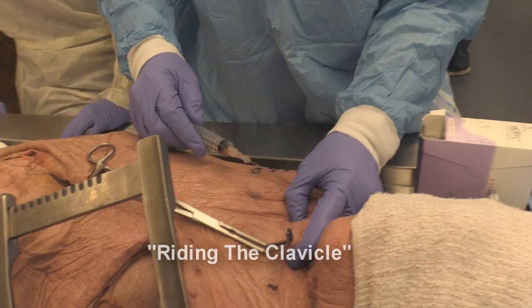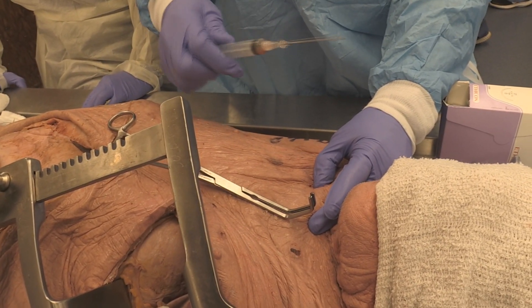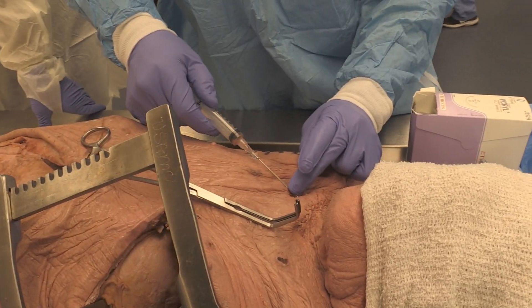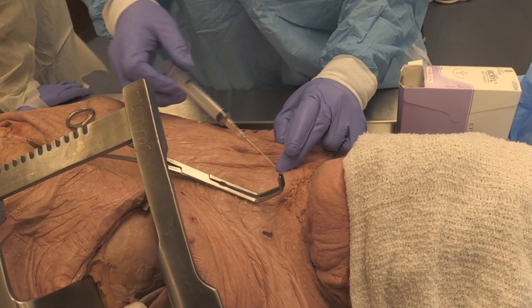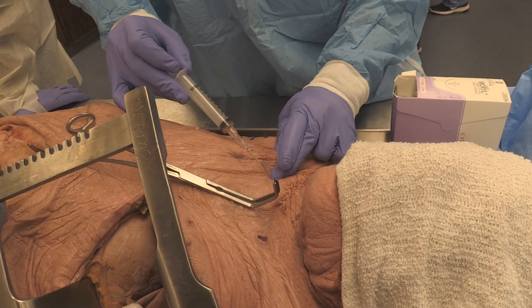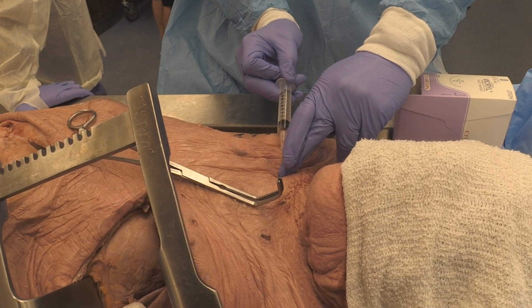Riding the clavicle — I find it right here, push it in with bevel up, because I'm going to turn my bevel and it'll go straight in like that. I push it in, I feel the clavicle. I don't turn yet. I walk underneath the clavicle. As soon as I walk it up underneath the clavicle, then I make that turn — boom — like that in the middle.